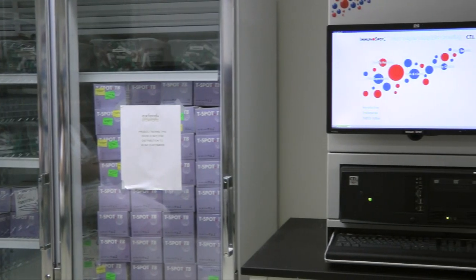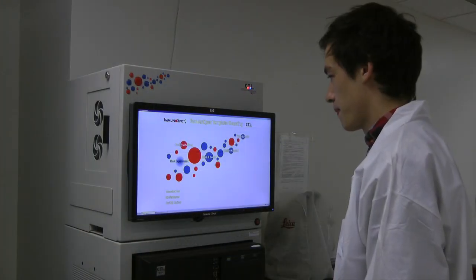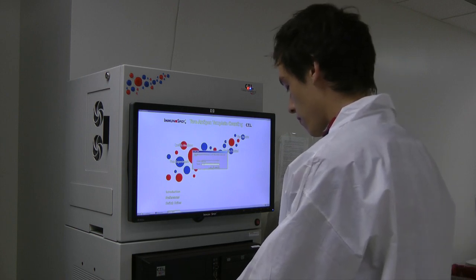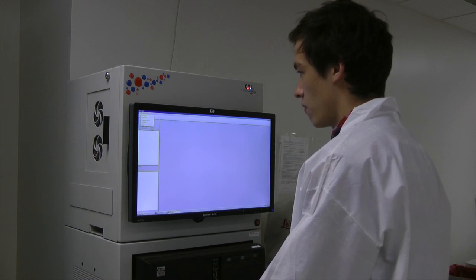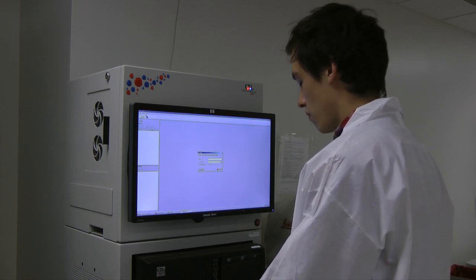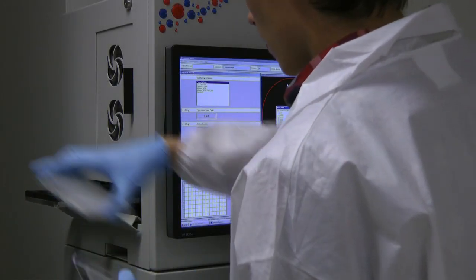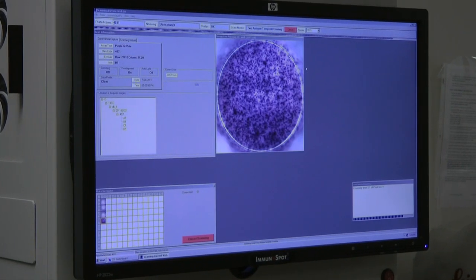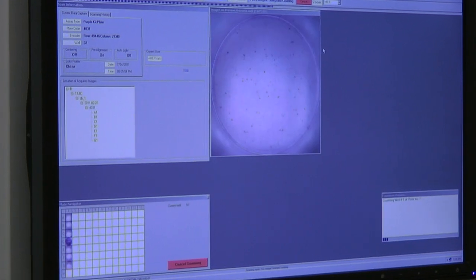An Ellispot plate reader manufactured by CTL is used to count spots on a T-spot TB plate. Software customized by CTL for the T-spot TB assay allows for rapid counting and quality control review of spots. The technologist opens the scan and count application and imports the sample accession numbers from the laboratory information system. The unique plate identifier is entered and the plate is loaded onto the instrument. Spots in each of the 96 wells are counted by the CTL plate reader, a process which takes less than five minutes.